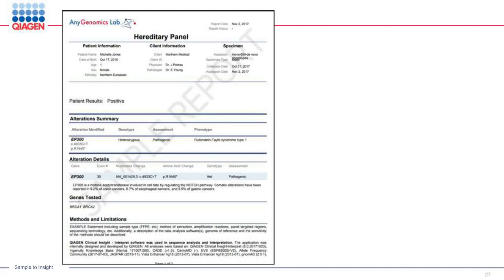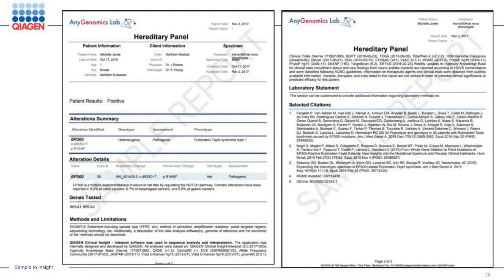And then finally, you can see in these notes what version of the knowledge base is being used, and all of the different builds of the different databases and data types that we're pulling from to come together and build a knowledge base. So to keep it consistent and know that when I reported out this variant, this was the particular build of dbSNP that was used in the assessment. And also, I selected those certain citations and things that were relevant for me to include in this report. So we've got my HGMD accession number, my ClinVar accession number, and a number of citations that are relevant to this particular variant.